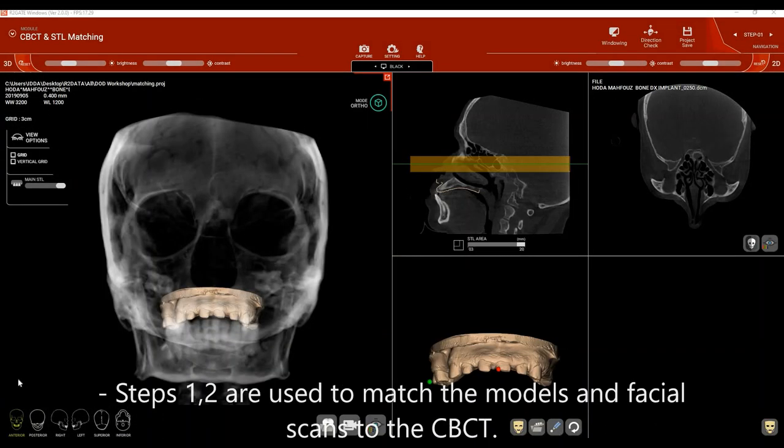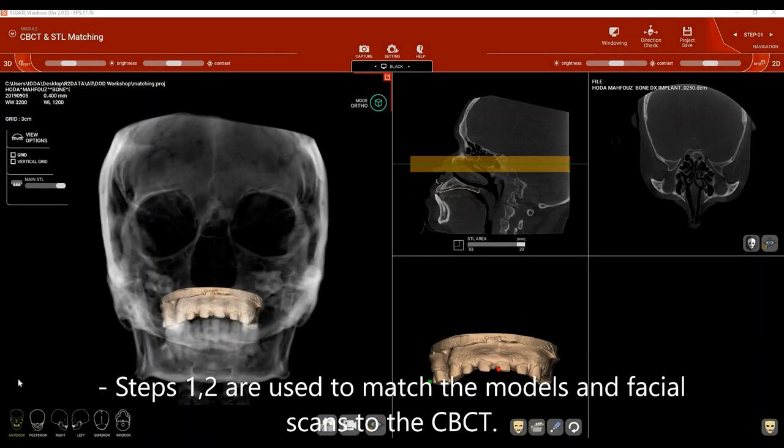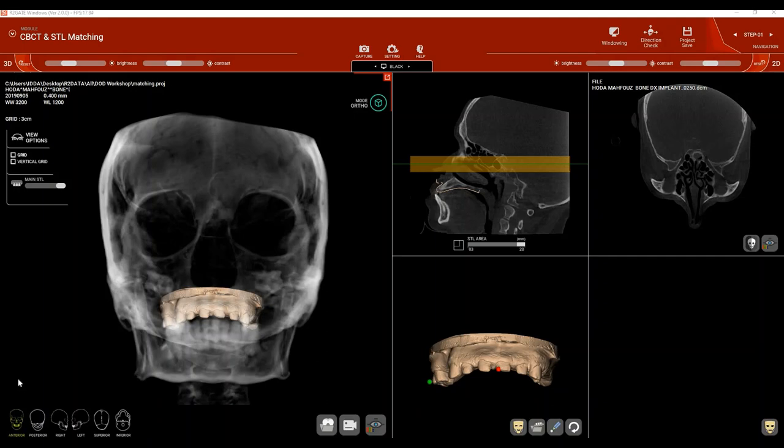In step number 1 we match the model to the CBCT and match the facial scan to the CBCT. To learn how to match the model to the CBCT, please refer to video number 1 of this series, which teaches you how to match the model to the CBCT step by step.